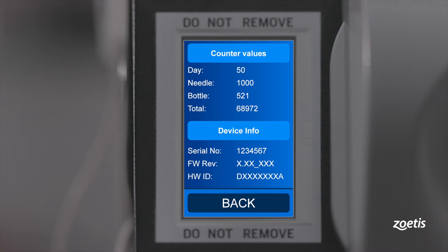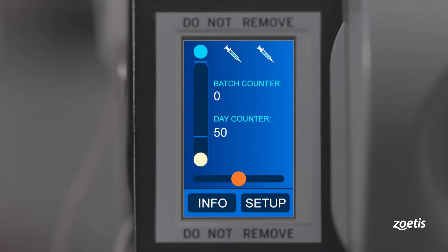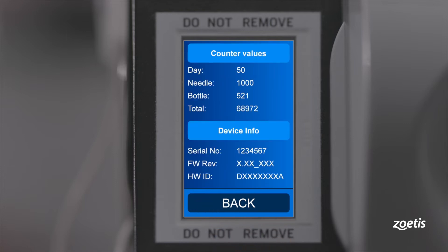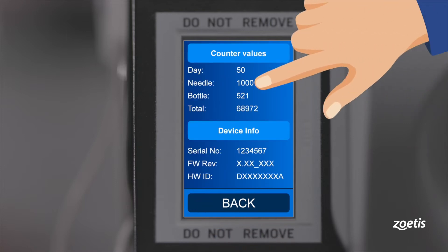Without a reset, the counter will count the next 1000 injections until the warning appears again. To reset the counter, simply touch it on the display.